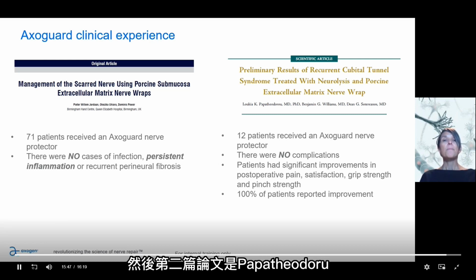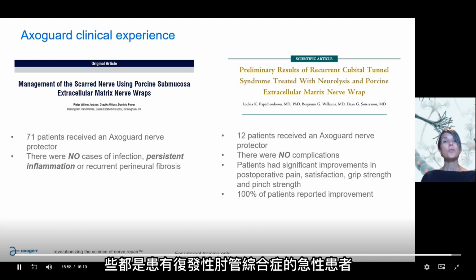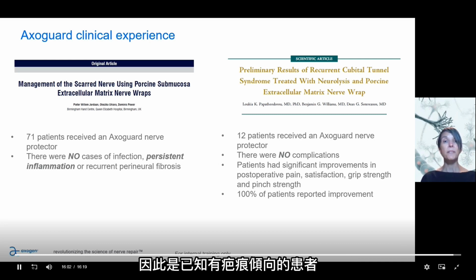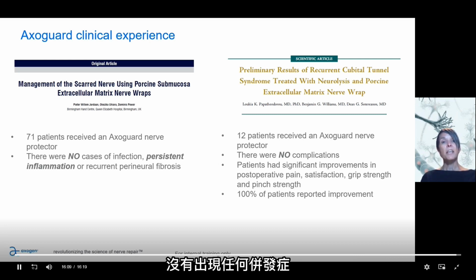And then the second paper here, by Papatheodorou, actually looked at outcomes after use of Axoguard. These were patients who had recurrent cubital tunnel syndrome, so patients with a known propensity to scar. And what they found is that after use of the Axoguard nerve wrap, there were no complications, and the patients had significant improvements in pain, satisfaction, grip strength, and pinch strength. And 100% of the patients reported improvement.